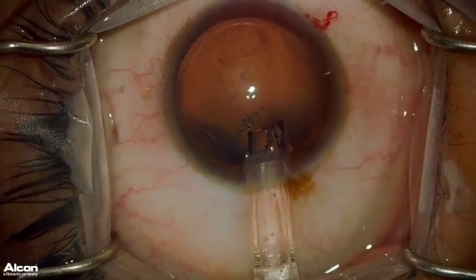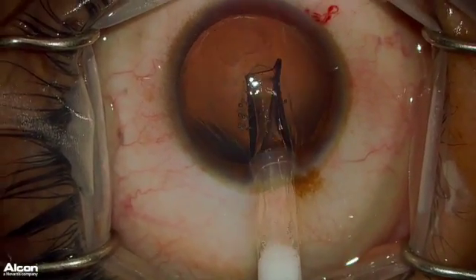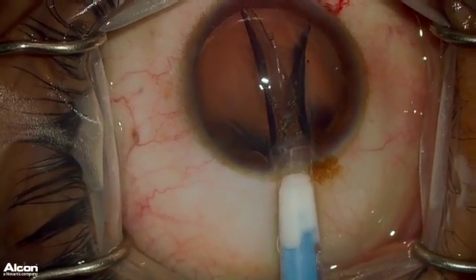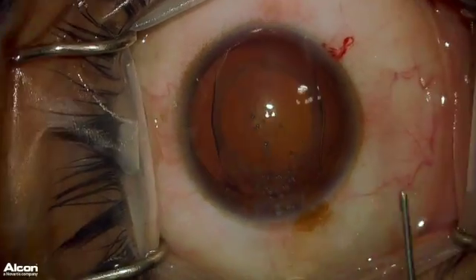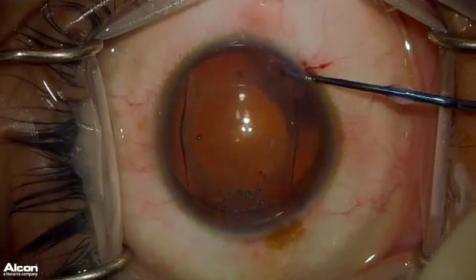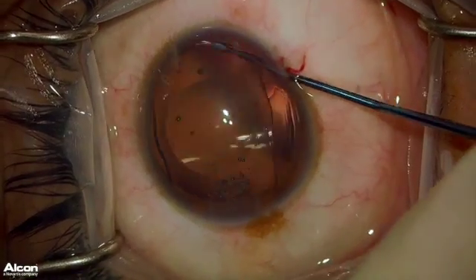As you can see, the ICL is coming out perfect in the correct orientation. The ICL footplates begin to unfold, and as you can see, the ICL is in the correct orientation. Adding some more OcciCote on top of the ICL, and now taking my lens manipulator and dialing the ICL into the sulcus.